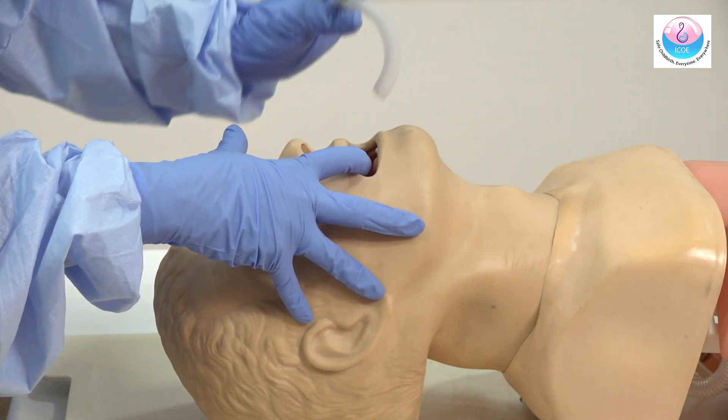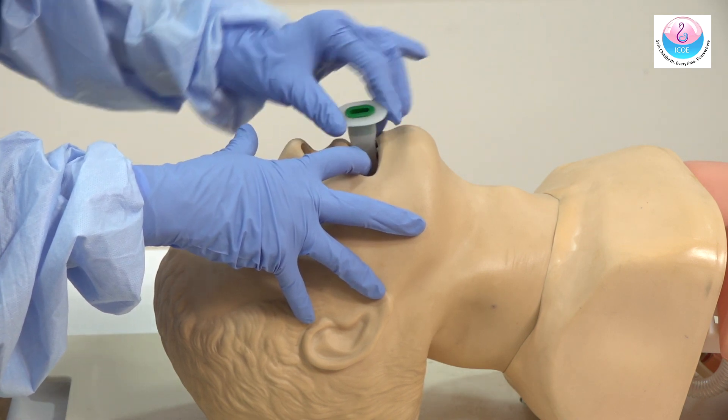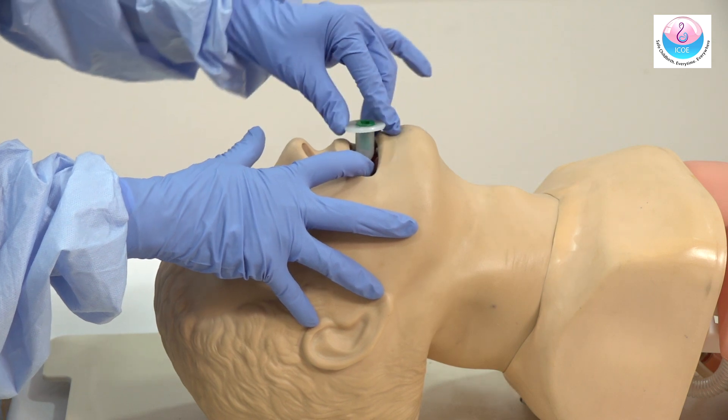Insert in a reverse manner with the tip facing the hard palate of the mouth, then rotate it 180 degrees and gently push it until it lies at the pharynx.